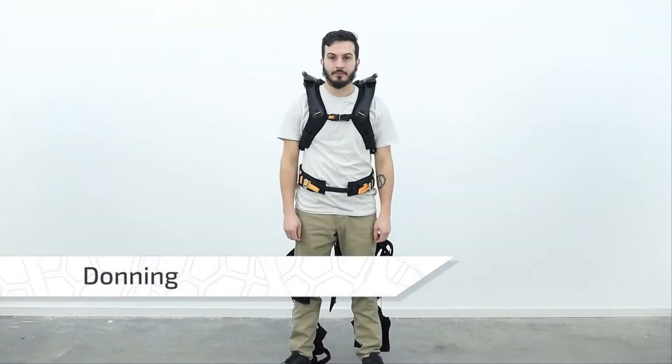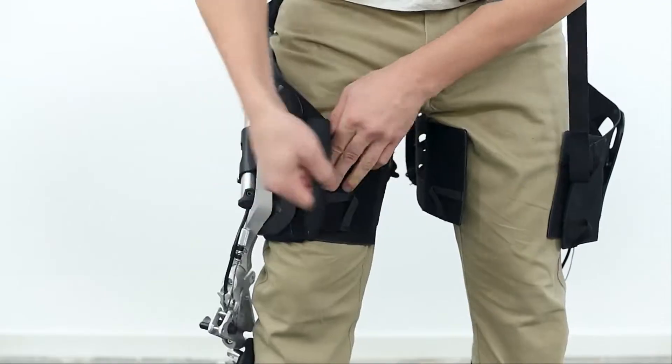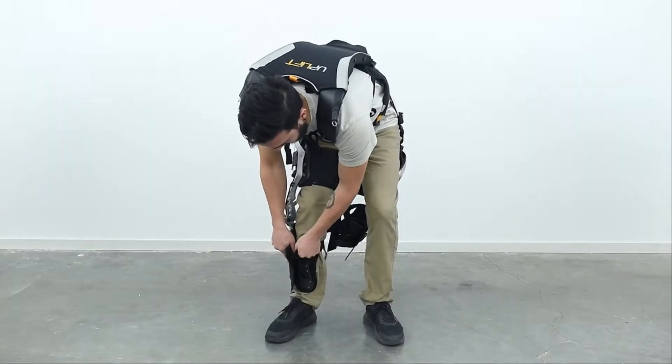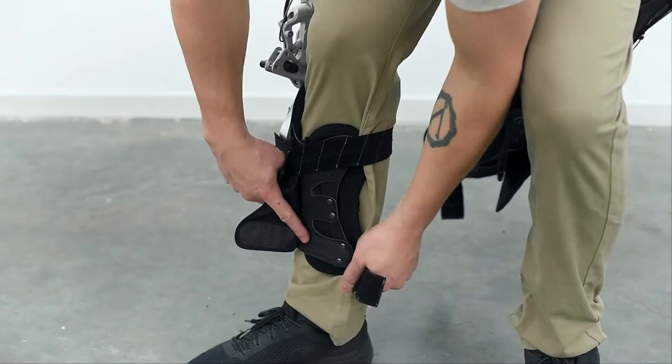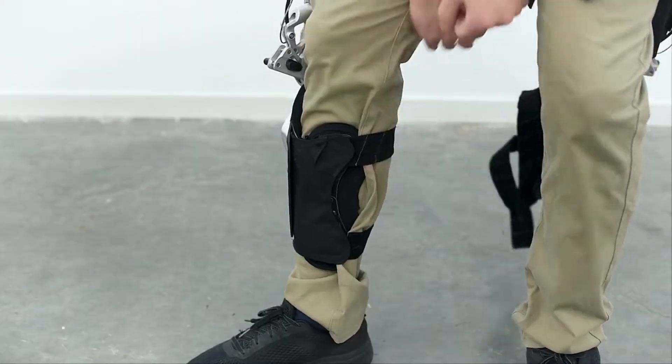While wearing the back module, fasten the thigh section of the leg module like you would with the back module's thigh harness. Then, connect the corresponding shank harness, making sure to leave enough room for muscle expansion, and repeat the procedure for the remaining module.